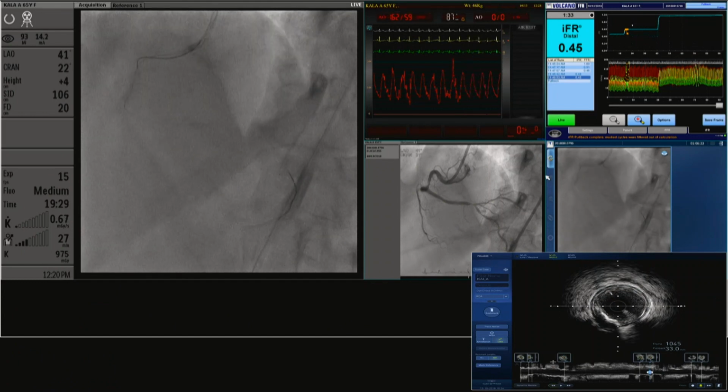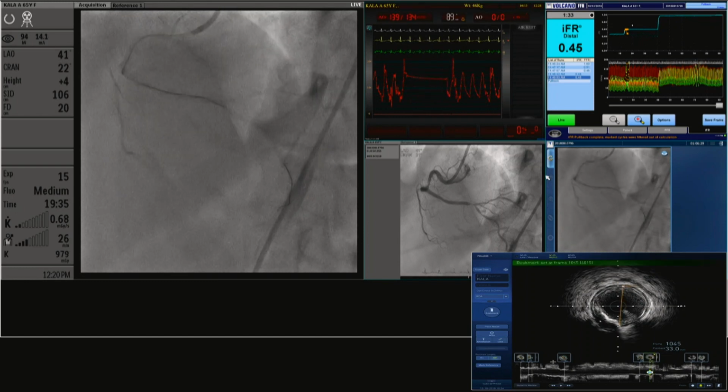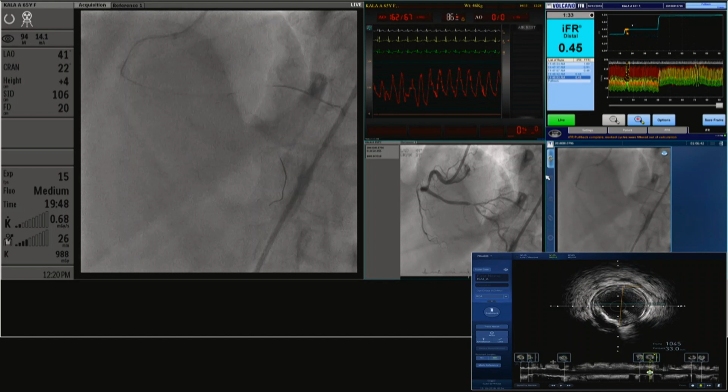And small check down. Right. So I expect difficulty in tracking a few things down. I'm going to put this down the PLV so that I have buddy support. And what I'm going to do, Ajit, is actually ask you a question, which is important and I think very relevant.